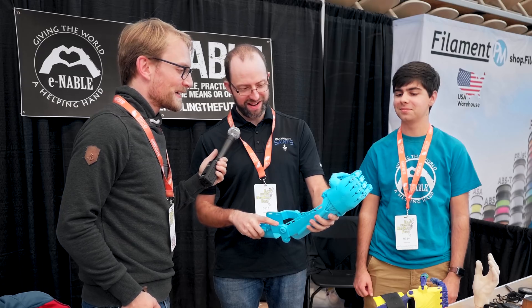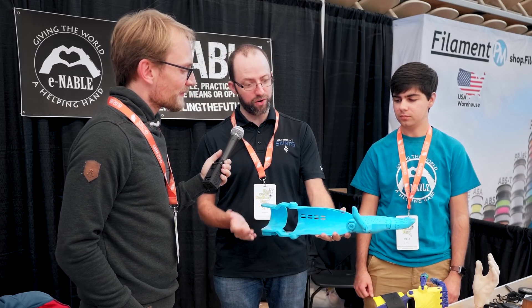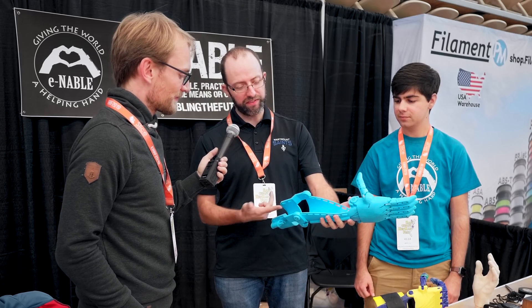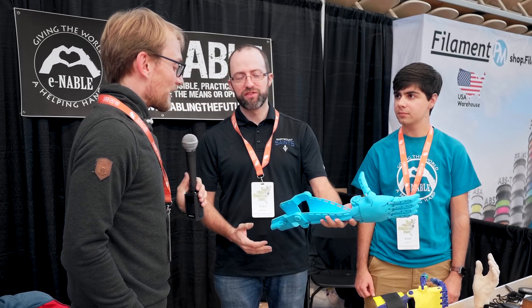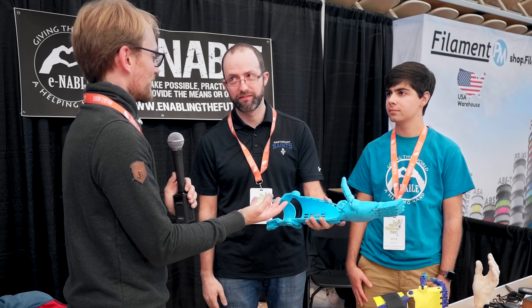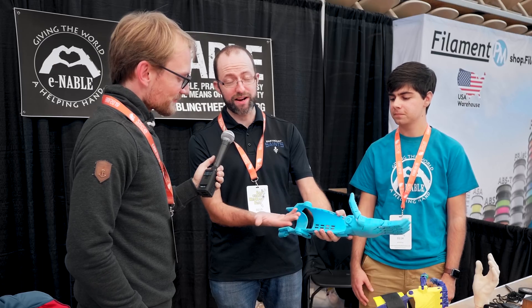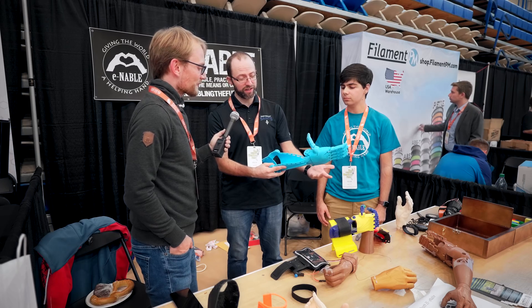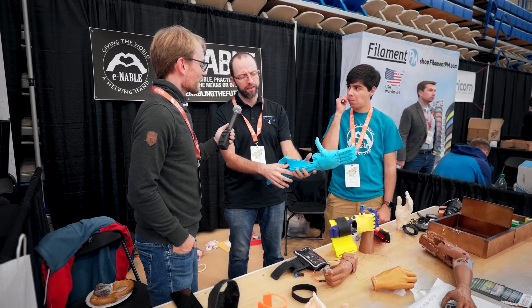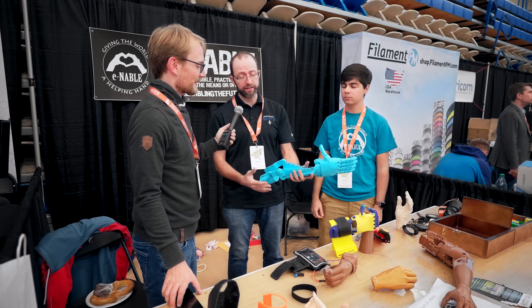It's a very nice mechanism. We'd line this with medical grade foam. And the very cool thing — this was amazing when I first learned about it — we print these pieces flat and then we just thermal form them. With PLA, you don't have to heat it to a scalding hot temperature; you can form it at a touchable temperature. We just heat it up with a hairdryer. And you would wrap your recipient's arm in a sock or some kind of cloth, and then you could directly wrap this around them and get a really nice tight fit customized to them.